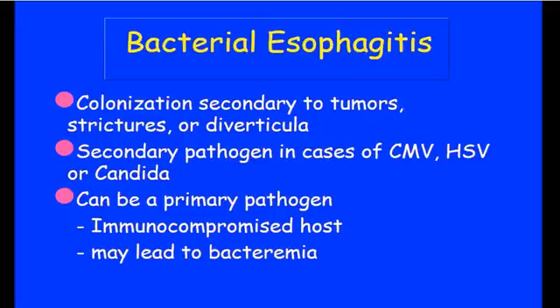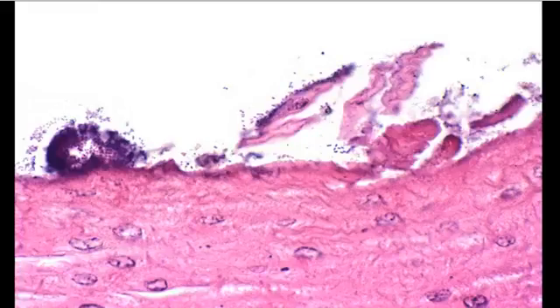But there are case reports of people going into septic shock from bacterial infections in their esophagus. I've never seen one, but it exists in the literature. This is what you more typically see, which are just some bacterial colonies clinging onto squamous mucosa. There's no host response, and this is just colonization, which I typically ignore, although when I see a lot of this in a biopsy, I'm worried that there must be some obstruction nearby.